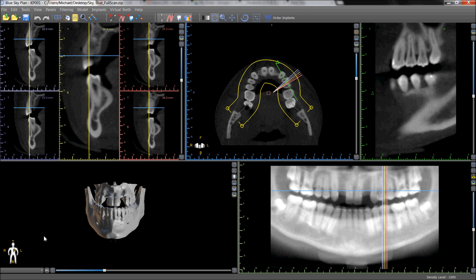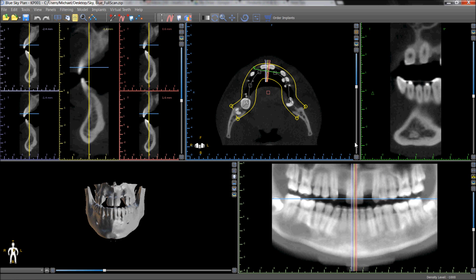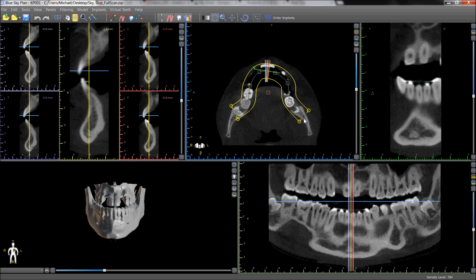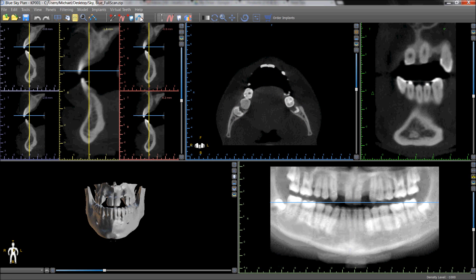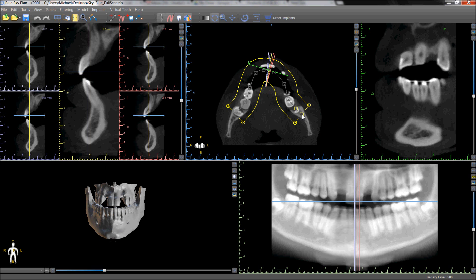The user can also define a third custom curve by going to the panoramic button and choosing Custom. The relevant axial slice can be selected and the curve placed as desired. A new curve can also be drawn by clicking the Draw Dental Curve button, placing dots along the arch and then double-clicking when the curve has been completed.